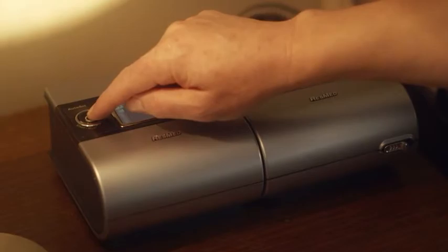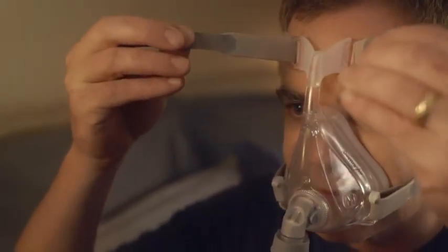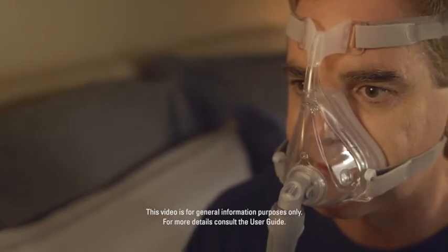Turn on your machine so it's blowing air, and then undo the fastening tabs on the upper headgear straps. Reposition them only enough until a seal is achieved. Then reattach both, and you're done. Your mask is now ready to use.